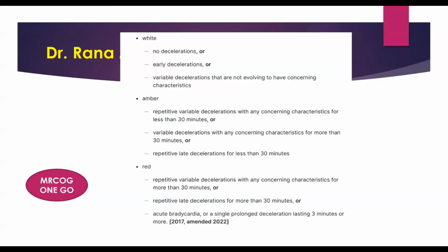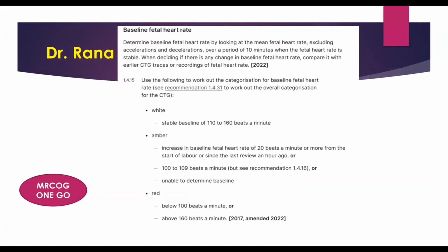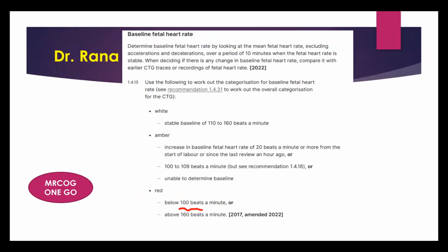Acute bradycardia or single prolonged deceleration lasting for 3 minutes. What about acute bradycardia? So now in the basal fetal heart rate, I will go back here. If it's less than 100 beats per minute, this is bradycardia. If we have the bradycardia acute, what is the meaning of acute?